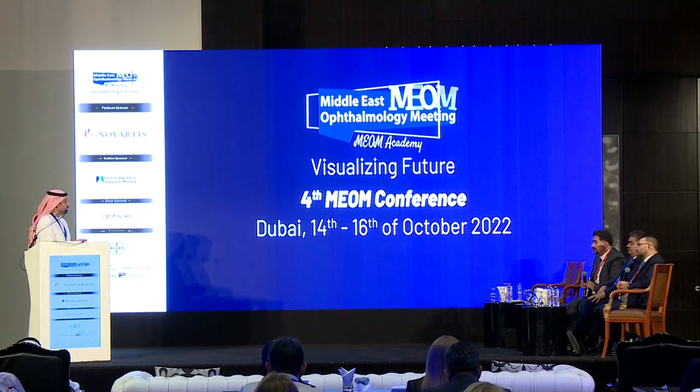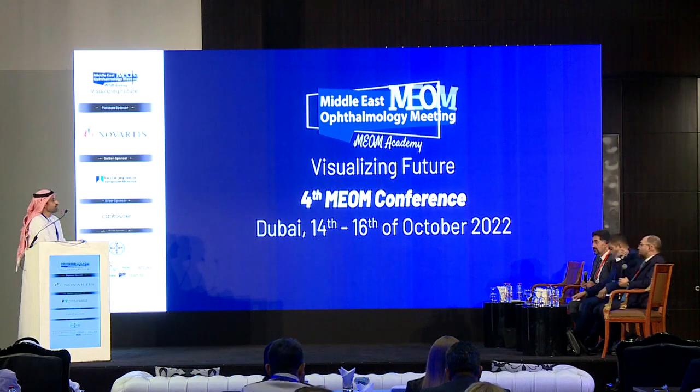So, to take your second point, what will you do if you have a patient, you wait for 1 year, it was very stable, the patient is very happy with the spectacles, you decide to do an ICL and you did it. And after 1 year or 2 years, he returns to you with a regression. I did an ICL already, a TICL, with 1 year of stability, and the patient was very happy.